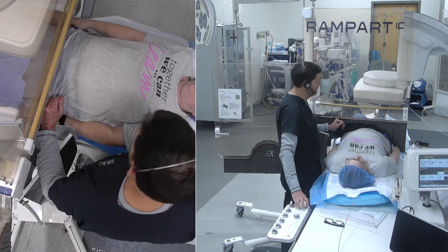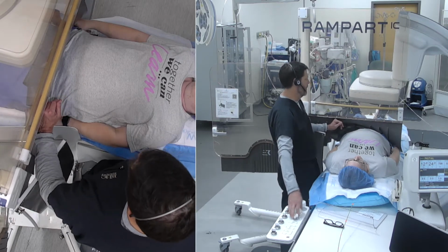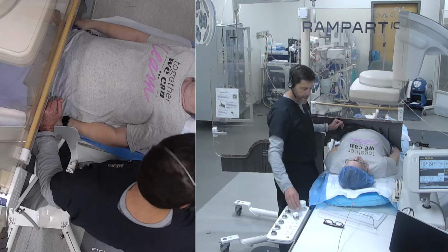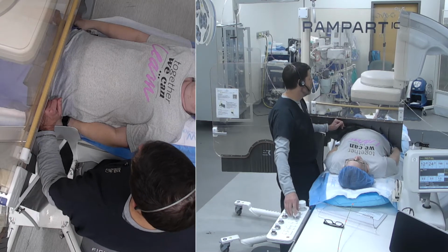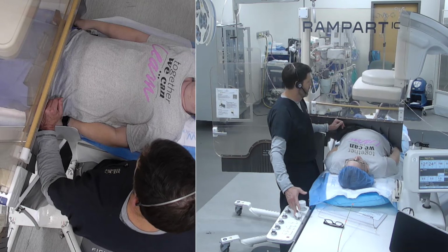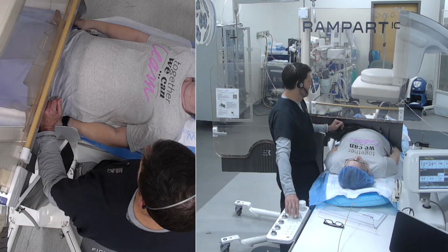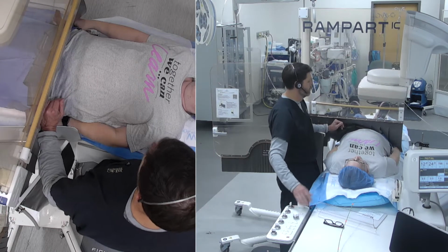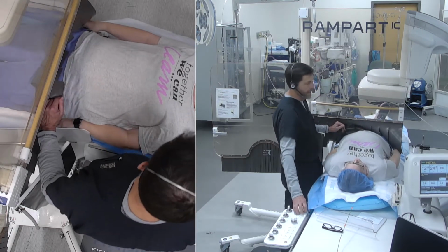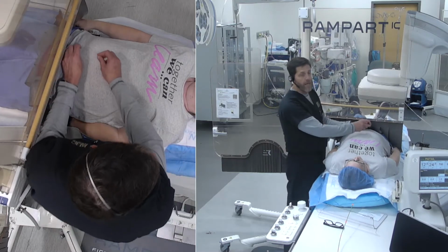and go straight down the leg and do your SFA, or again, just move your camera down, and you can move the camera all the way down the leg and do pedal approaches. So if you want to go all the way down the leg, you can do a pedal access, just move the camera down, or again, you can pan if you want to. Okay, so that's anti-grade stick, right and left.